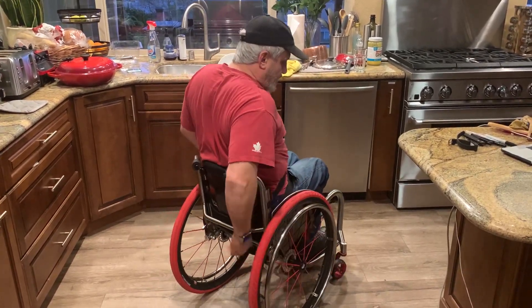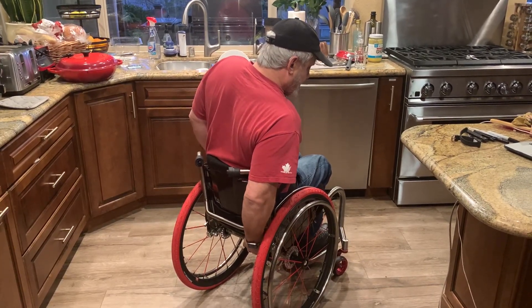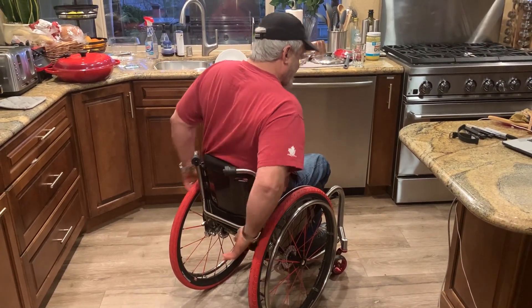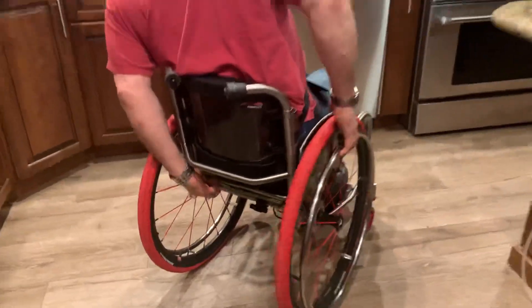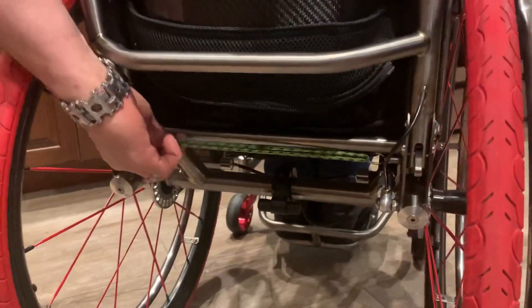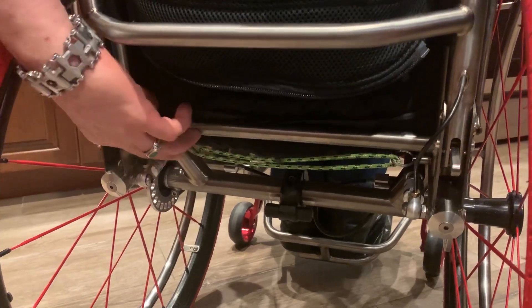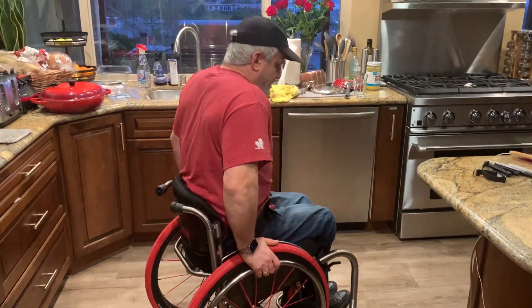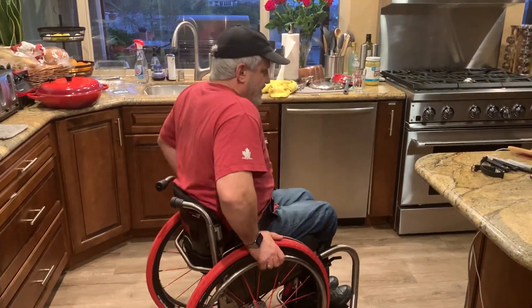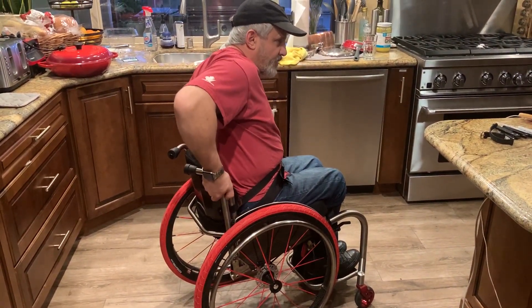Now I'm going to release this part down here, which is the safety release. There are a couple of spring plungers down here — get a good look at those. Both of these things have released from the whole triangle, but the chair kind of sits up a bit now. I've got this trick little thing.